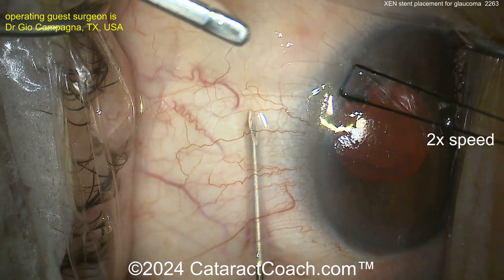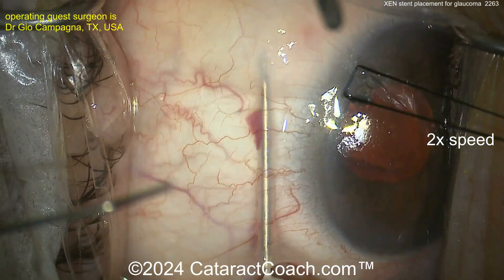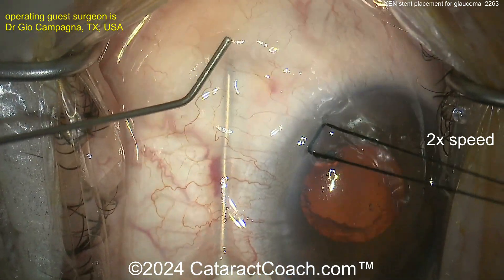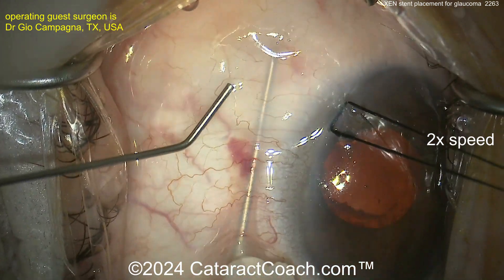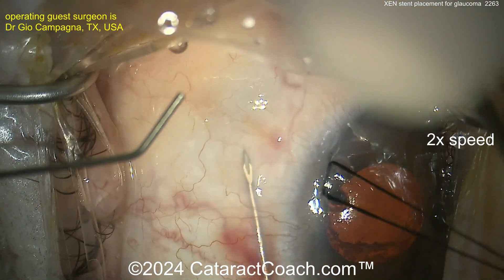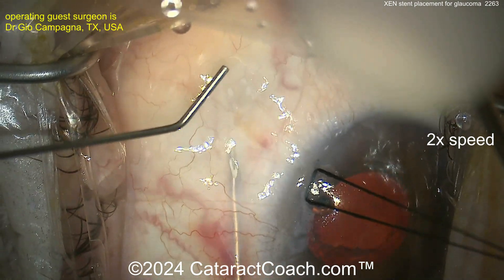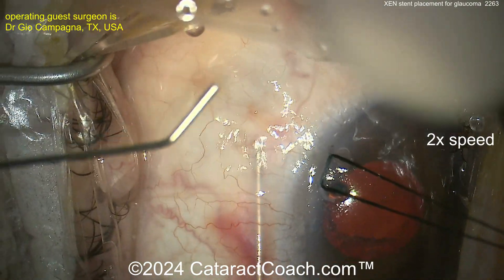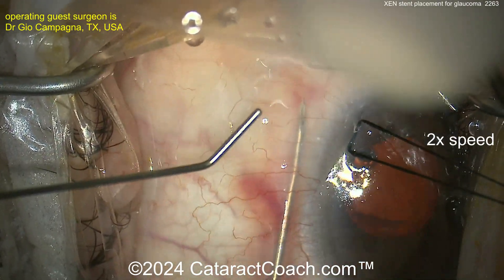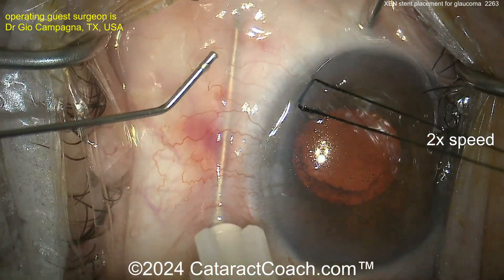It's important to sweep the Tenon's away from the distal tip so you get a nice big bleb with adequate outflow. If the tube gets clogged by pigment or inflammation post-op, the lumen can be lasered with the gonio mirror — about two millijoules, just a few shots. Notice how the needle tunnels under the conjunctiva over that area; you don't want a hole in the conjunctiva where the bleb is going to be. This two-handed technique looks pretty good.